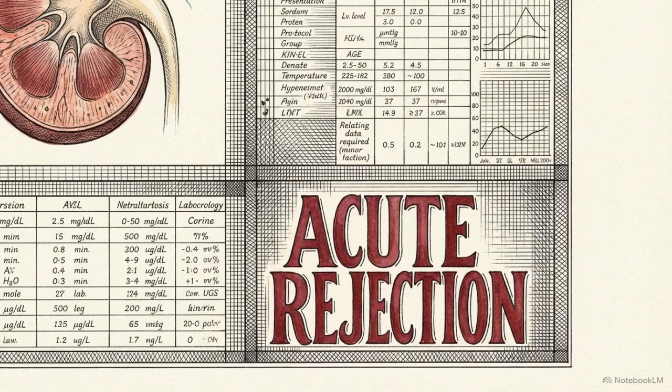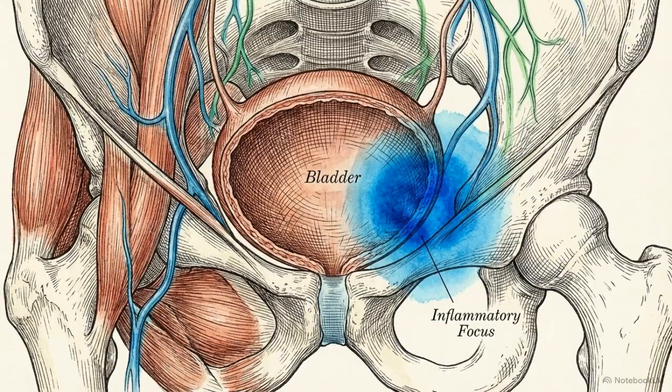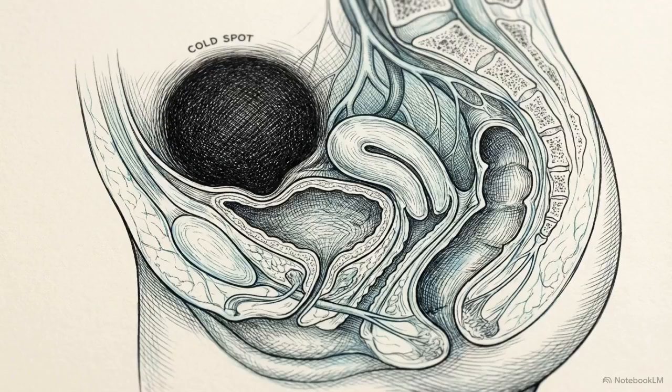Acute rejection presents as a catastrophic failure of both metrics. The graph shows profoundly poor blood flow alongside delayed excretion. We also use the tracer to identify post-surgical fluid leaks. Urinomas pool the radioactive fluid, appearing as hotspots outside the bladder. Hematomas and lymphoceles contain no tracer, presenting as cold, photopenic defects pushing against the anatomy.